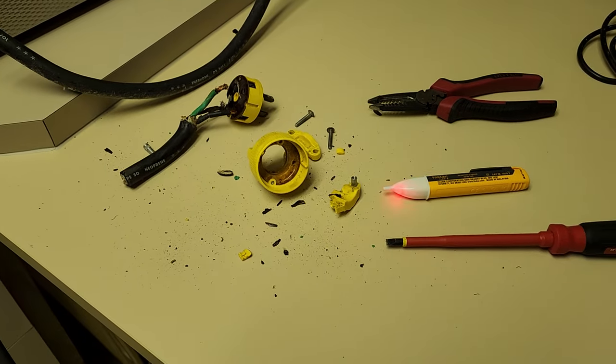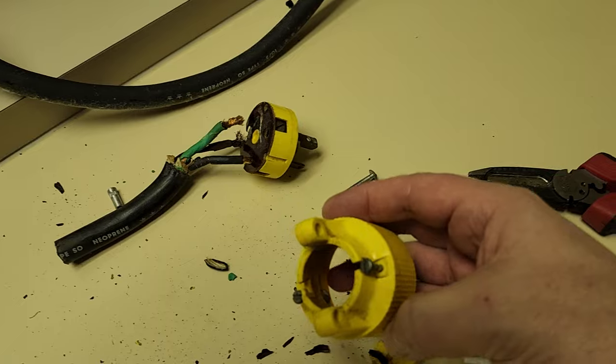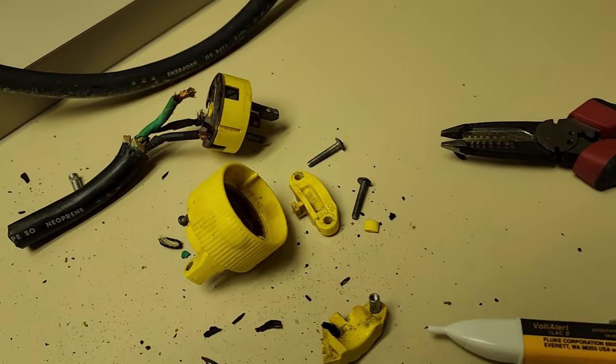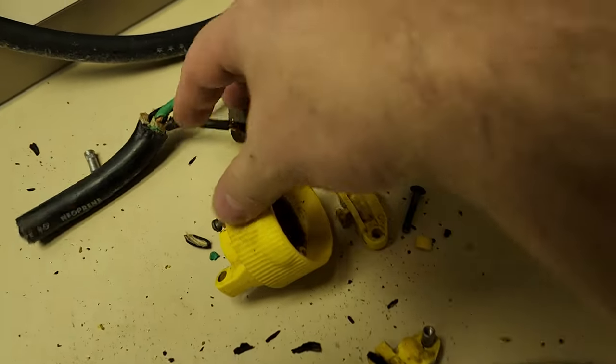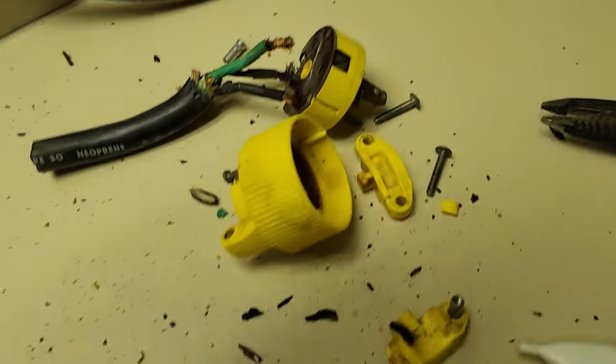Where do I even start? So when I came in, this guy here was pushed back, and it was actually impacting against this guy right here, and that caused some of the wires to kind of bind and hit each other, and they got hot, apparently. You can see the plug has definitely had a hot supper.